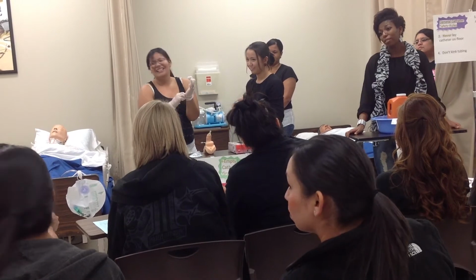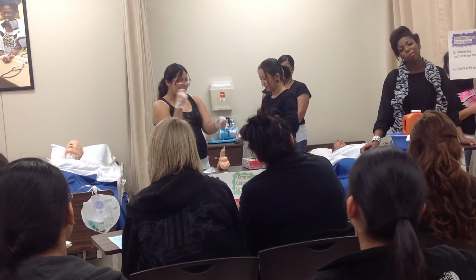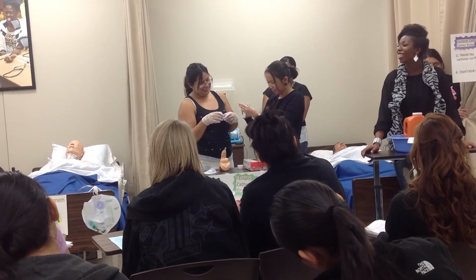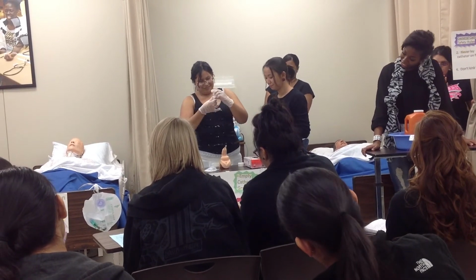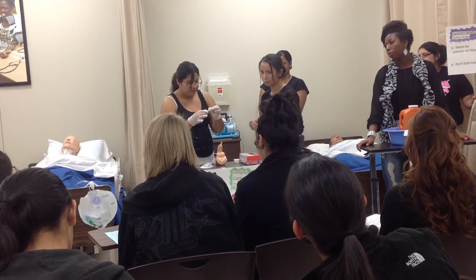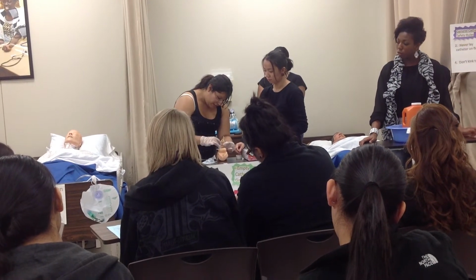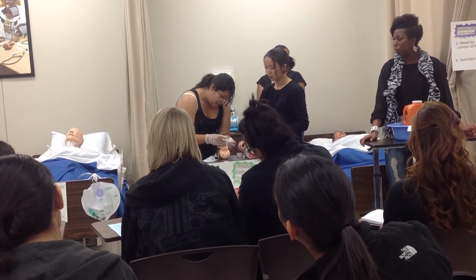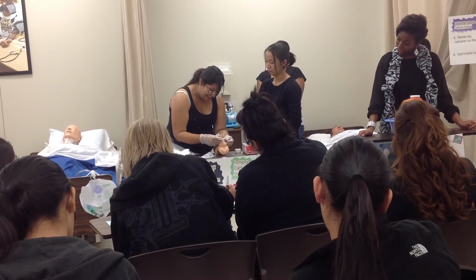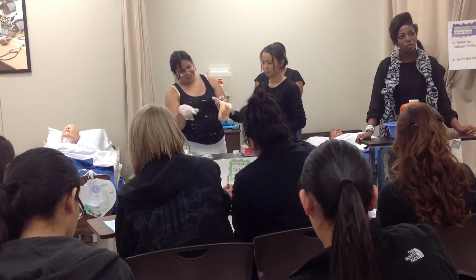We don't know how to work the tape. Just don't make it where it cuts off circulation. You're going to want to tape on the catheter itself. You're not going to want to tape the skin. So you're going to go ahead and tape that. Go straight up in a spiral motion, not overlapping the tape. And that helps keep it in place. So in a nice spiral motion.